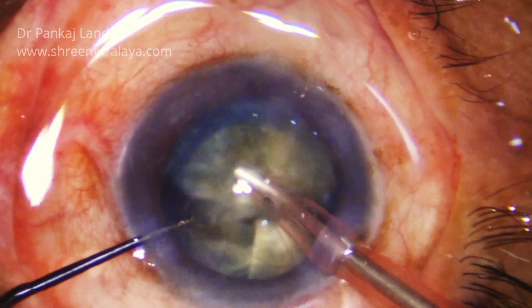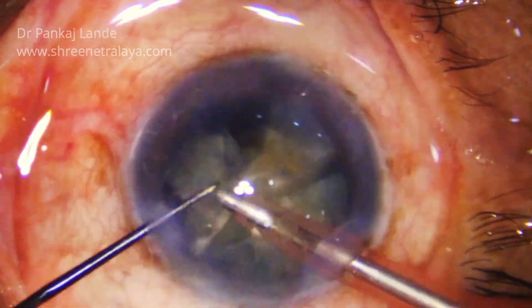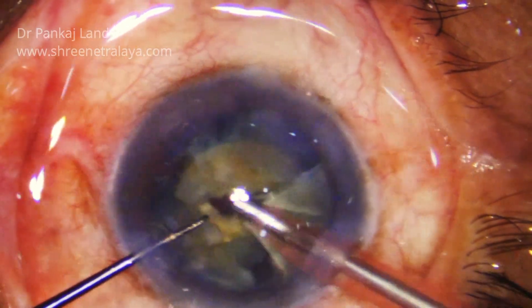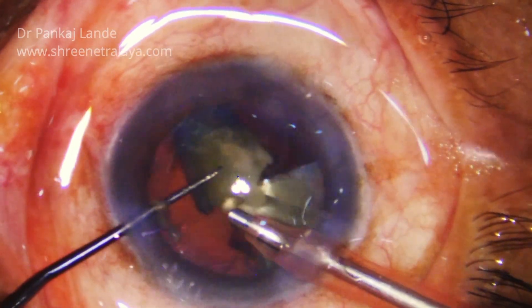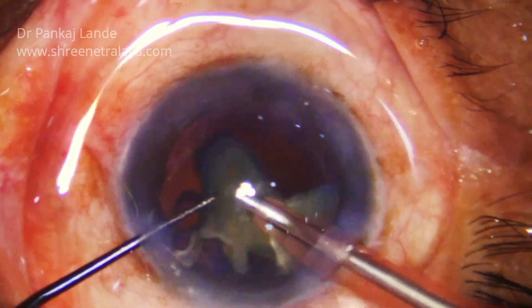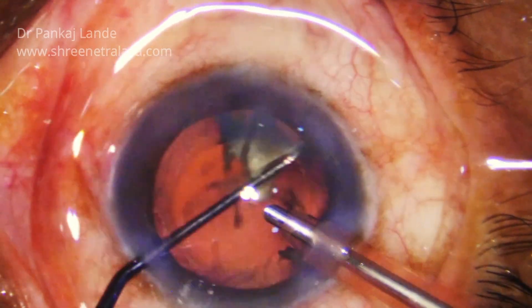This technique can save a lot of endothelial loss during FACO emulsification in hard cataracts. Ultrasonic pre-chopper is not required in softer cataracts. Viscoelastic used in all my cases is HPMC, but in initial cases you can use a higher density viscoelastic which will help to manage the case well for beginners.